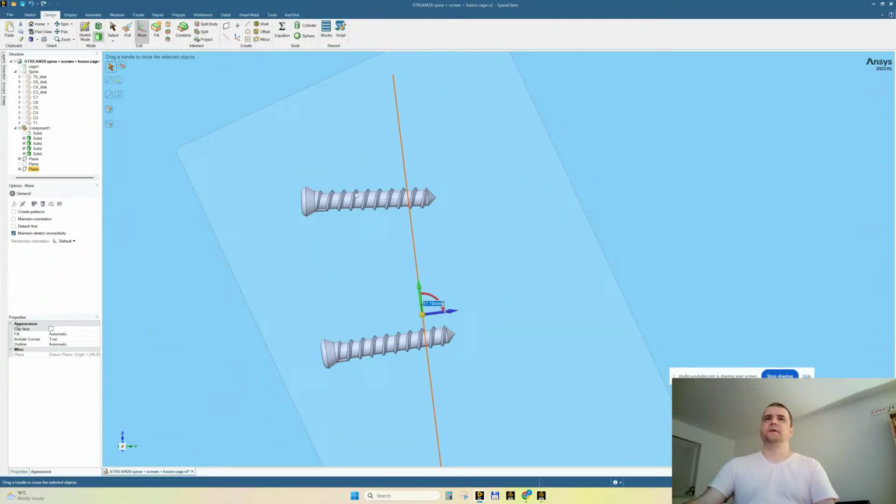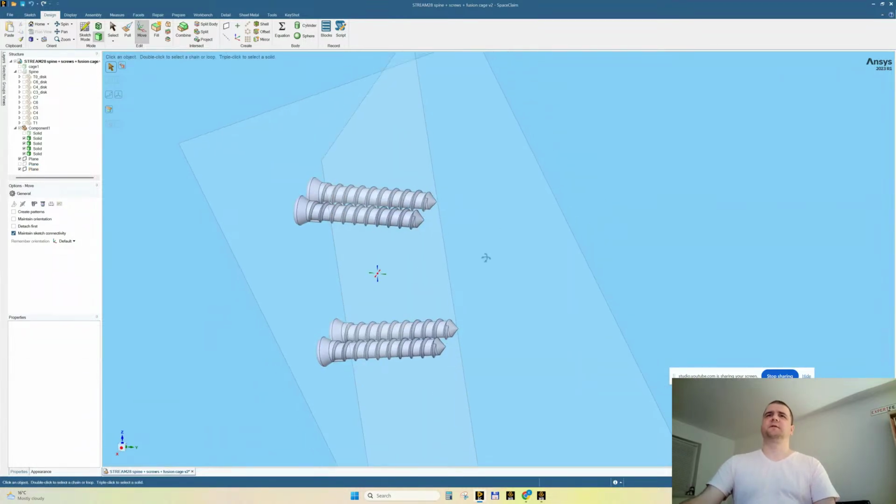1, 2, 3, 4, 5. Something like this. We're kind of there. Is it perfect? It's not perfect, but it works. This is the principle. This is the main idea.